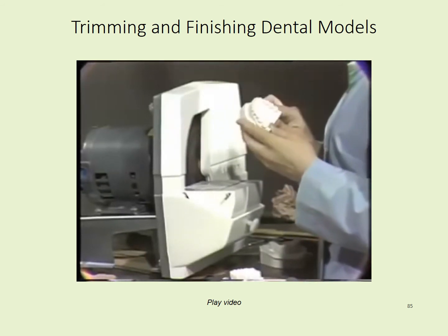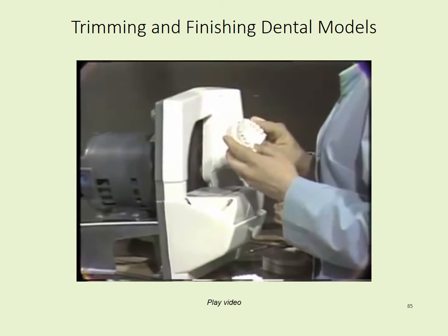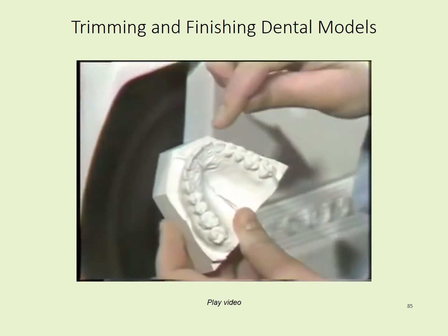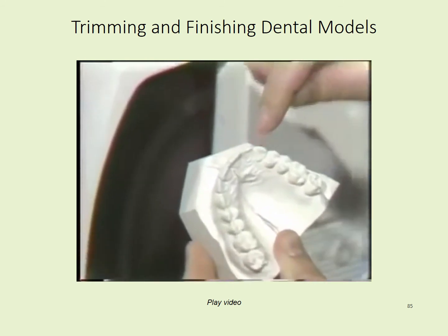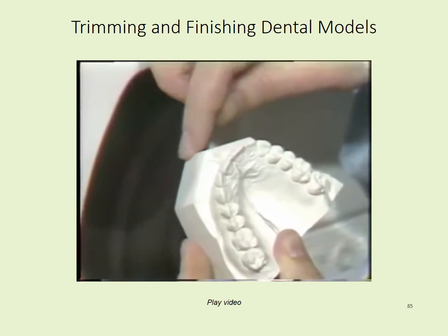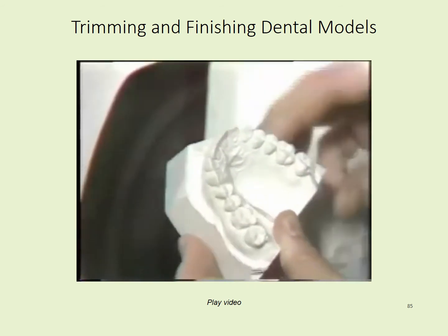After your sides are trimmed, you'll trim the front portion of the model. You should trim from an imaginary line opposite the center of your cuspid to the midline on the most normal side of the cast.